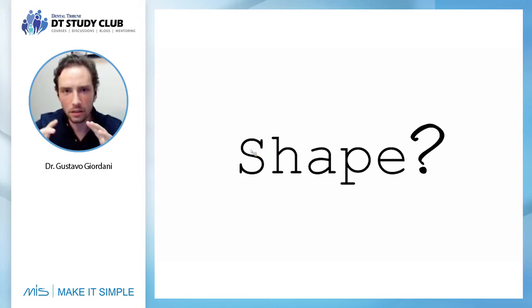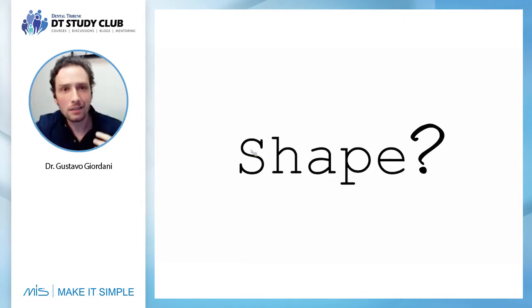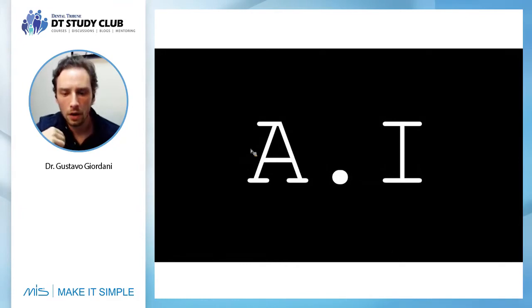We try to see the format of the face of the patient, the canines. It's really not easy to put the mock-up inside the mouth and have the patient say yes in the first appointment. Thinking about this, I learned from Florin how to use artificial intelligence, to use the software to select the best shape for our patient.